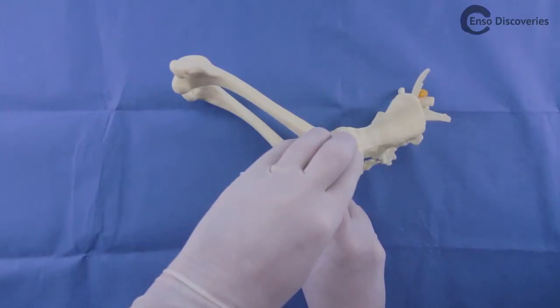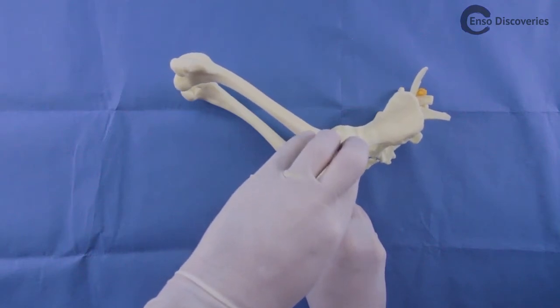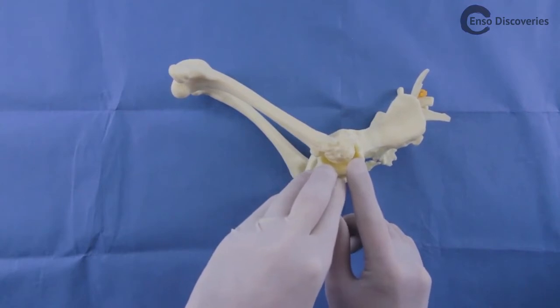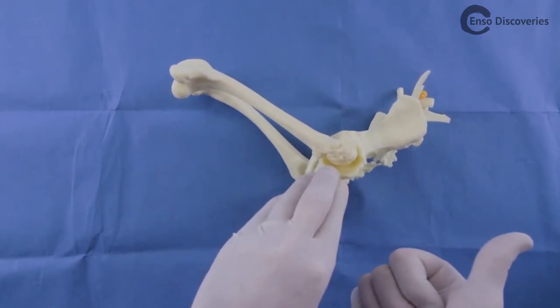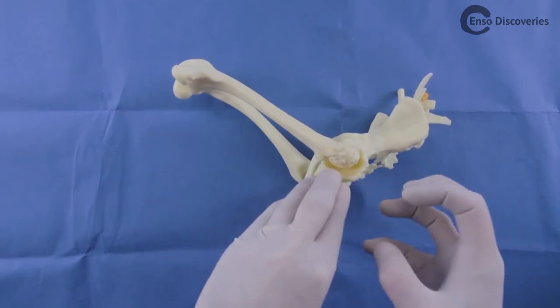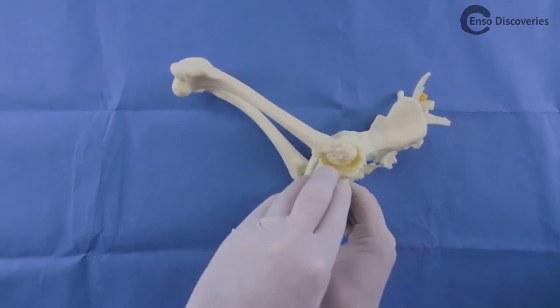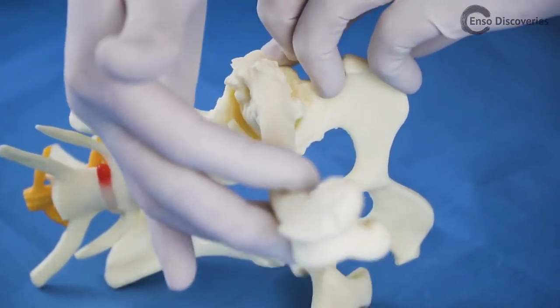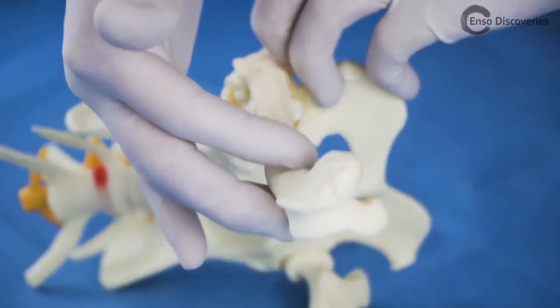To find the joint, lay several fingertips along the greater trochanter and walk them towards the spine until your index finger falls off of the trochanter. Determining the end of the greater trochanter can be difficult, either due to obesity or advanced pathology. Having the assistant gently raise and lower the stifle while you palpate can really help with this.